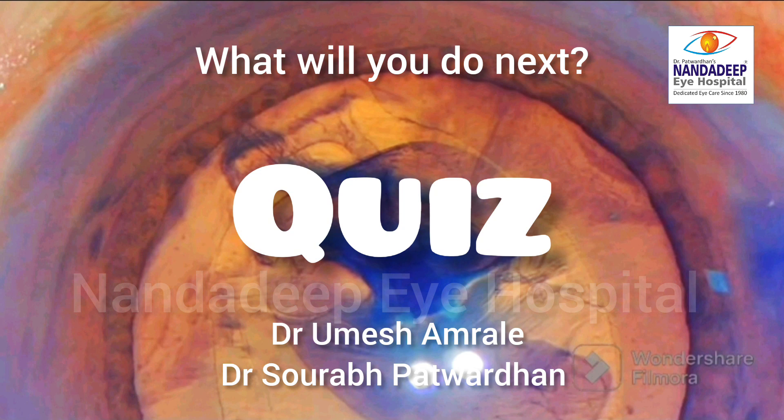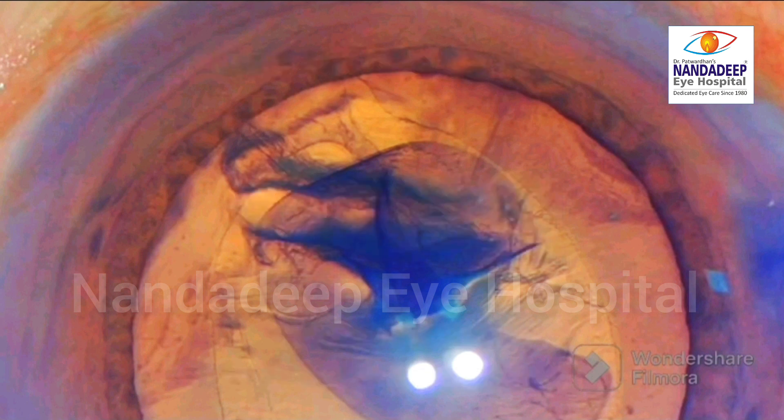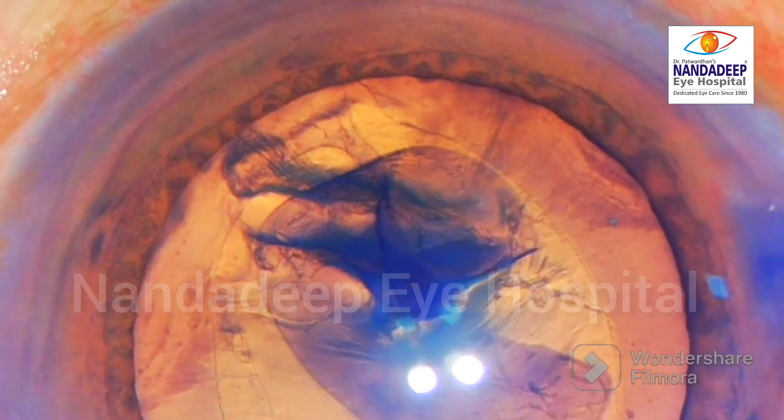In the previous video, I asked you a quiz: how will you proceed with this radial tear as you can see?